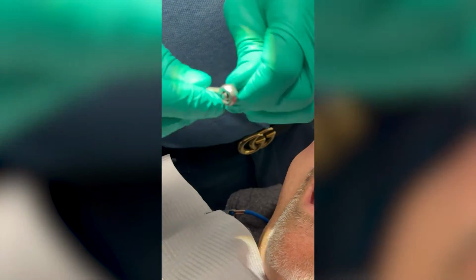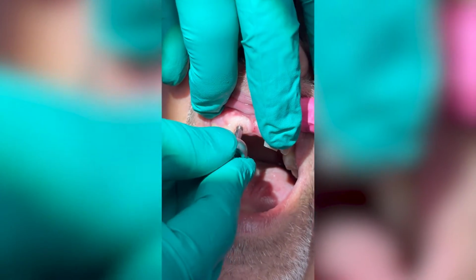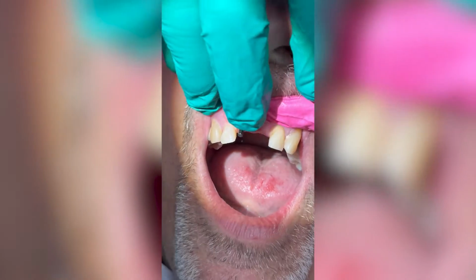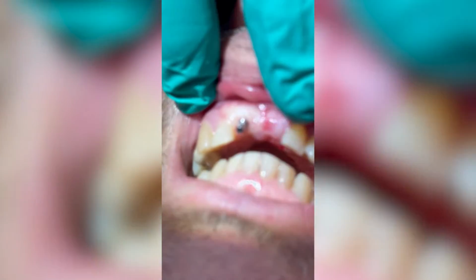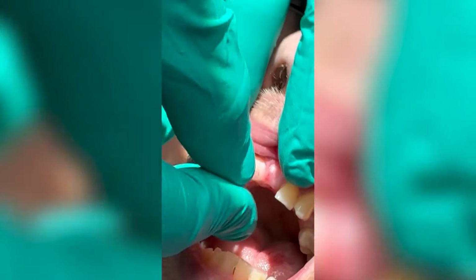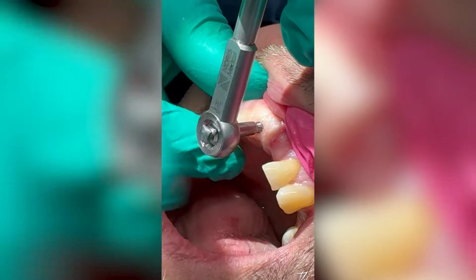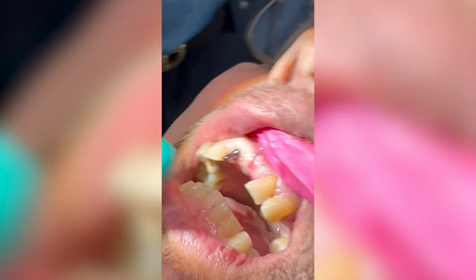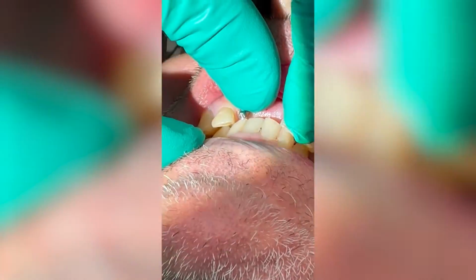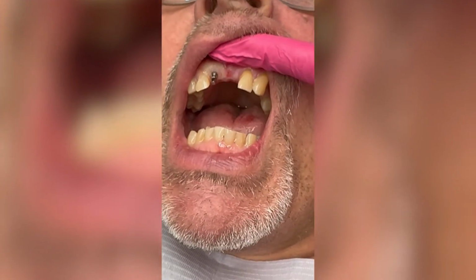So now we're going to go ahead and place this implant just a tiny bit more, and now bite together. Okay, and it's just a tiny bit facial, so I'm going to do a tiny amount of bending to the palatal. So I just put the driver on, hold my finger here, and just a very small amount of bend. Okay, bite together. Okay, now we're going to place the other implant.